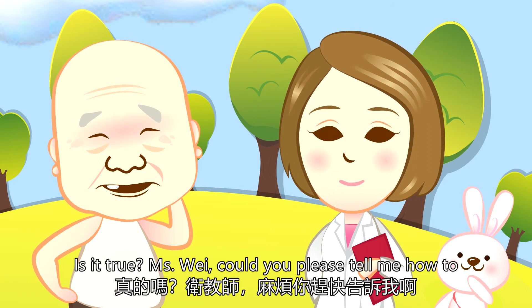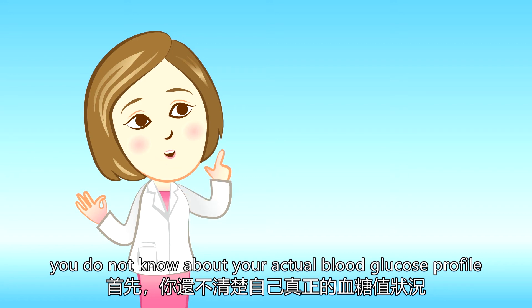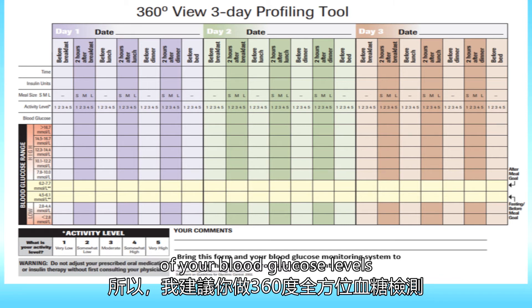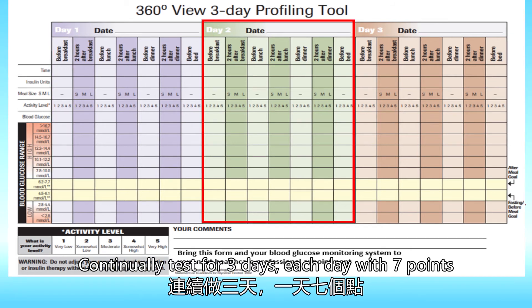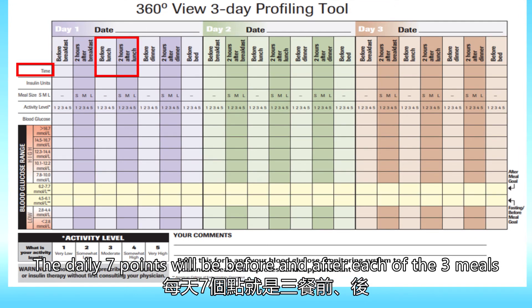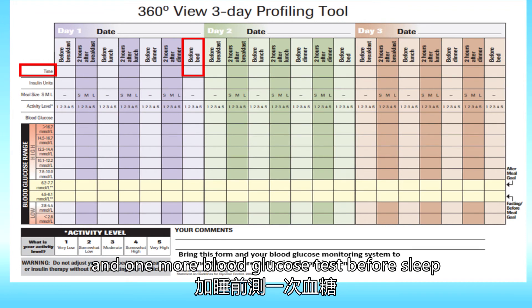Is it true? Ms. Wei, could you please tell me how to? At the beginning, when you do not know about your actual blood glucose profile, I will recommend you to do a 360-view testing of your blood glucose levels. Continually test for three days, each day with seven points, giving a total of 21 blood glucose values. The daily seven points will be before and after each of the three meals, and one more blood glucose test before sleep.